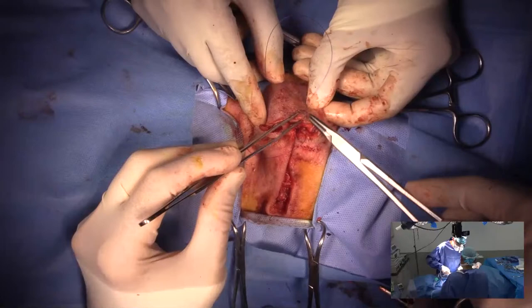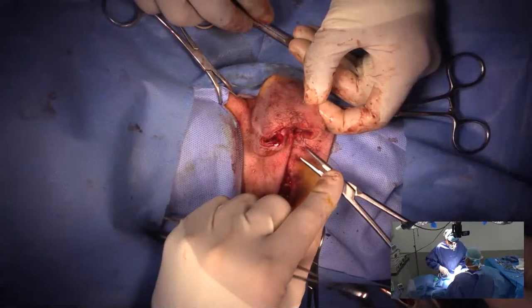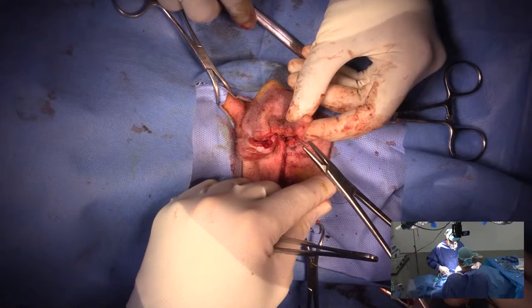I know there are studies about this, that in our practice we used to place an infusion catheter to administer lignocaine or bupivacaine the next 24 hours. What do you think about this? I think that's not a bad idea. So that is a soaker catheter, and we use them a lot more in maxillofacial, like maxillectomies, mandibulectomies, stuff like that. But I don't think that it would be a bad idea to do it in this situation. It's done a lot more commonly in people, but I think that's not a bad idea.